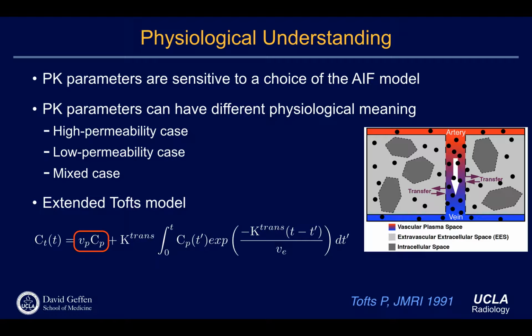And then PK modeling again, so in a lot of cases if you look at the DCE-MRI papers, some people are coming from the MR physics portion, tackling this or that. Some people are coming from more of the biology side. They're tackling here only, and then trying to say, instead of this, we have a better kind of modeling. It fits better, and it gives better physiological understanding. So there are multiple components, but again, the bottom line is you need to understand each component very carefully. And each equation is basically representing the steps. Okay? Any questions?